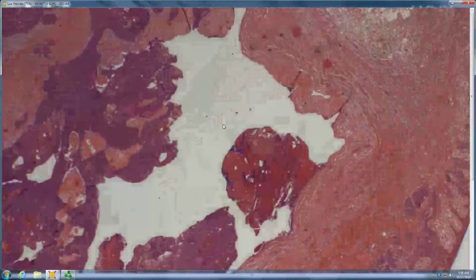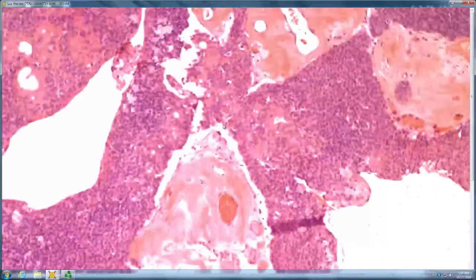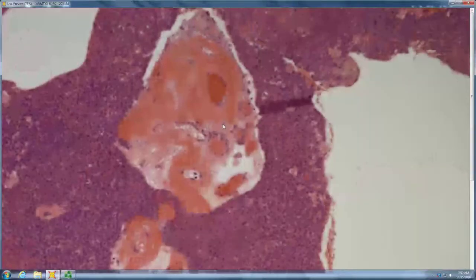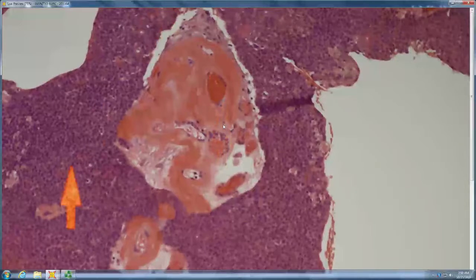There's a big dermal nodule with concentric fibrosis, and a lot of small blue cells. Okay, how about these little round clear things? Those are ducts. So they're ducts, and then how about this stuff where you have a vascular lumen in the center and this osteoid-like stroma around it? I'm not sure what we call that.